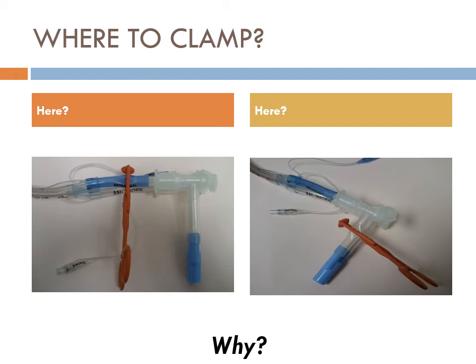So the air comes out of here, out of the trachea, goes down the right mainstem, but it's going to go to the area of least resistance. You have a thoracic cage sitting on top of your lungs. So yeah, it might ventilate some tissue, but it's going to go right through and back out this bronchial tube, come right out of here. Because again, you're hooking the circuit up to here, this is open.